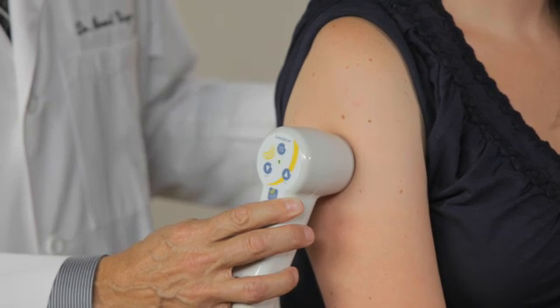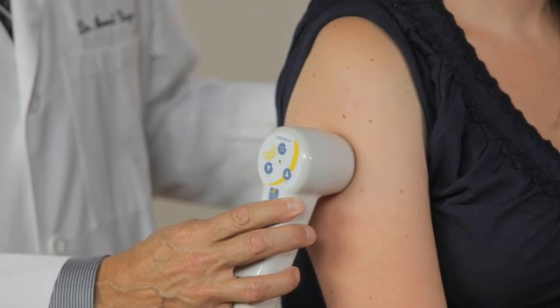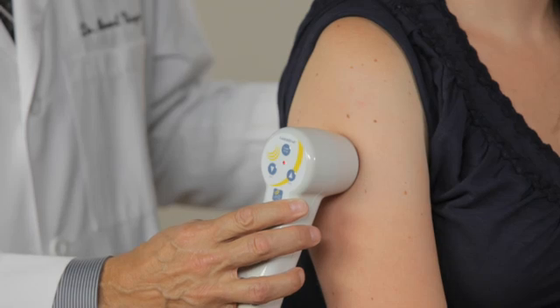It will continue to treat the individual and as we hold it, the light turns red. That is as much treatment as we need at that particular time. That tells us we are done.